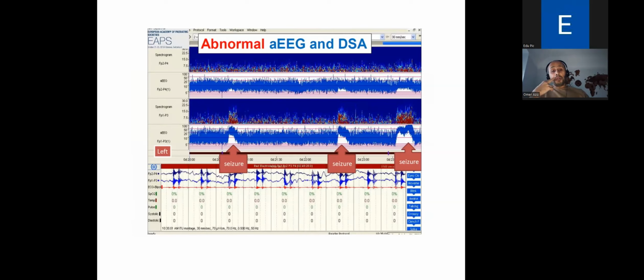If you look at the bottom scale, the CFAM, there's that sharp inflection point, which is a lot sharper compared to the original sleep-wake cycling, and so that makes you suspicious. It's also associated with a rise in the red color, which means that the amplitude has increased in size, and the frequencies have gone faster and bigger. It's predominantly on the left side. But if you look at the top side, i.e. the right side, there's a slight dip in there as well, in terms of a slight rise in the baseline.